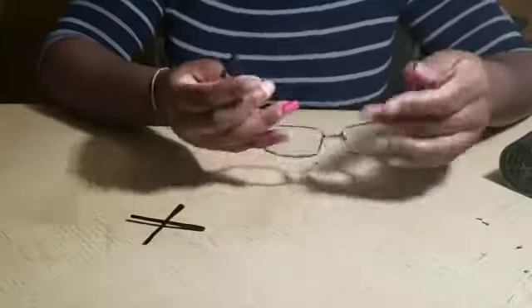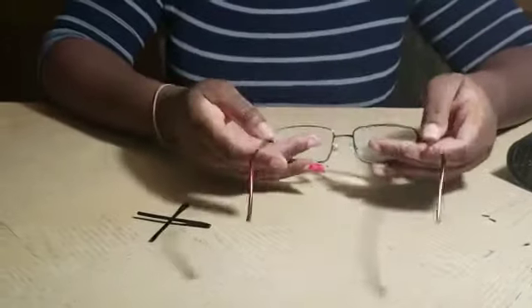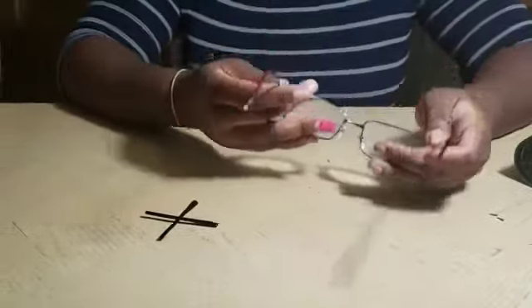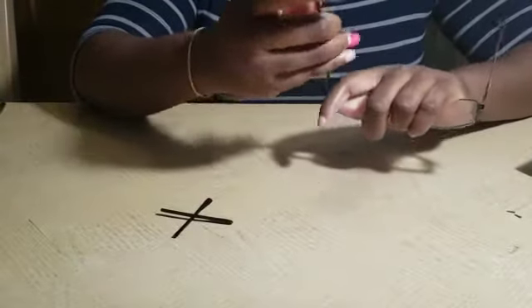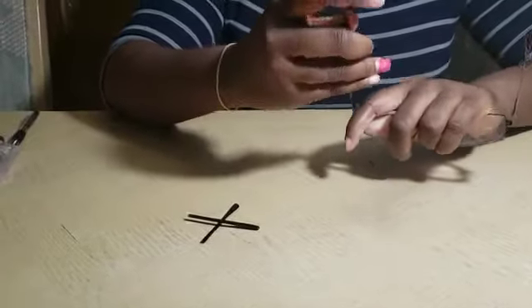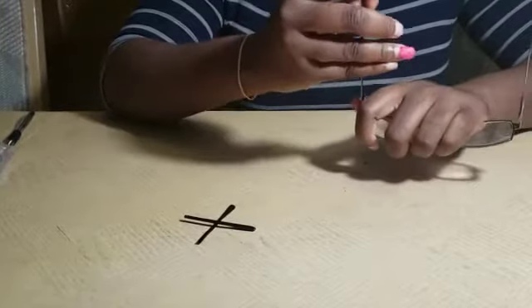In order to remove the temple tip, we need to straighten each temple out. Secure the frame and straighten out the temple tip with your fingers, making it as straight as possible.